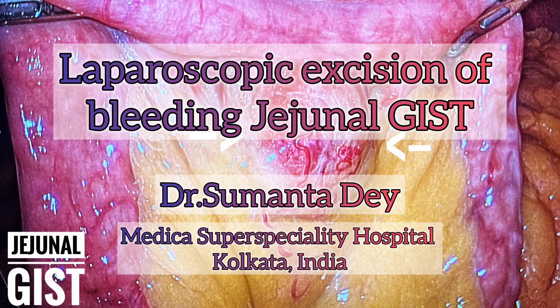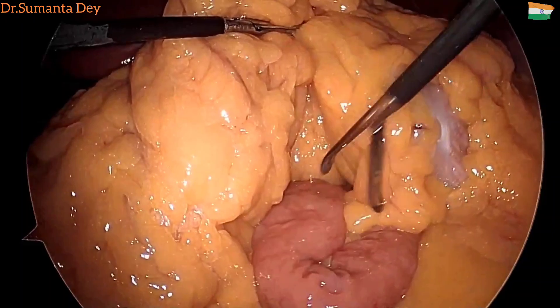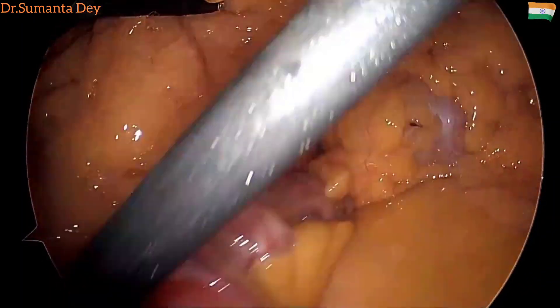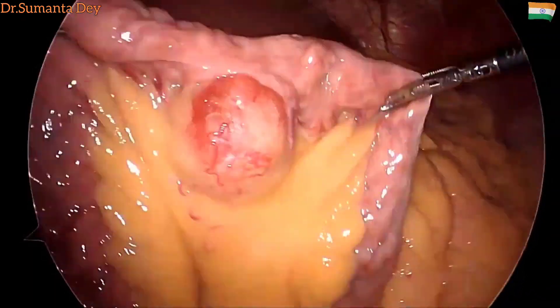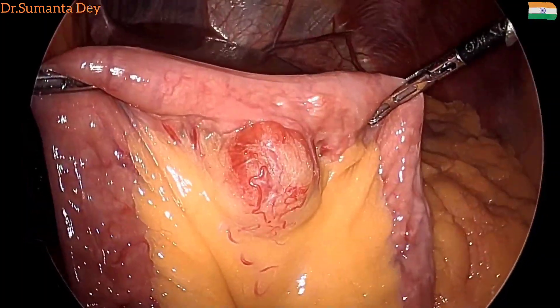Hello friends, this is a video of laparoscopic excision of a bleeding GIST tumor from the proximal jejunum. The 40-year-old male presented with acute melena and his hemoglobin dropped to six. He was evaluated at another center where it was found there is a 3x3 centimeter tumor in the proximal jejunum at the mesenteric border.